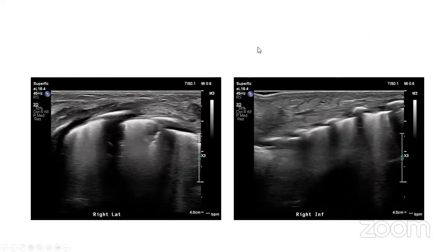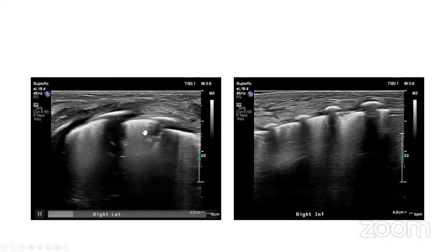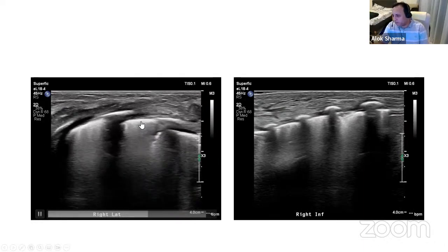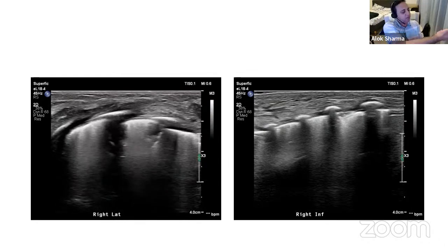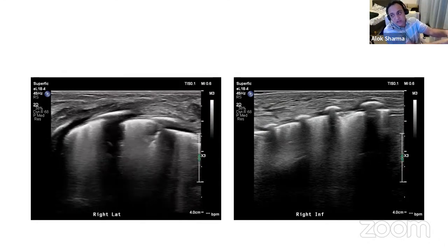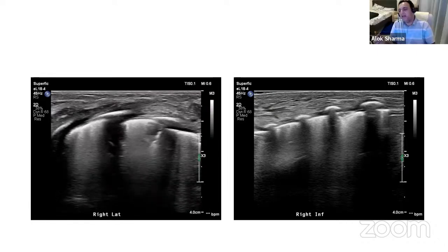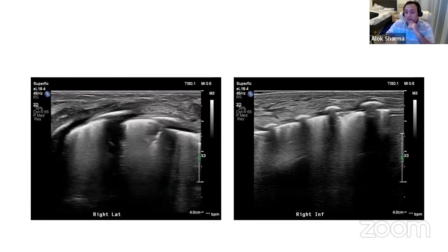What do we think over here? I'm sorry. Can you come back? If the left screen is transverse, why do we see acoustic shadows of the ribs? I'm a bit confused. What I'd say from my perspective is it's probably because for any baby, when you're looking at a transverse view, your probe might not be exactly parallel. The ribs might be very close together, so you will sometimes get shadows there. It also depends on the probe that you're using. If you're using a big linear probe, which has a wide footprint, you might find that the intercostal space is so close together, especially in extremely preterm babies, that it can be extremely challenging. But I think it's a good question.